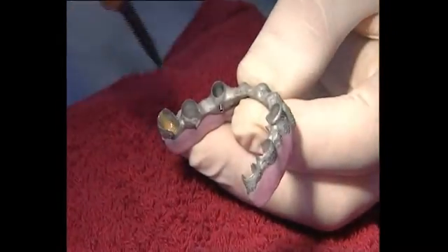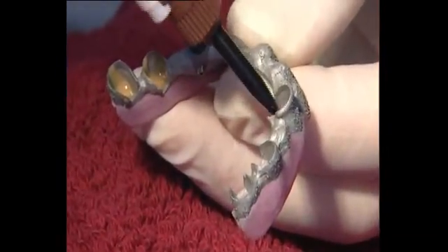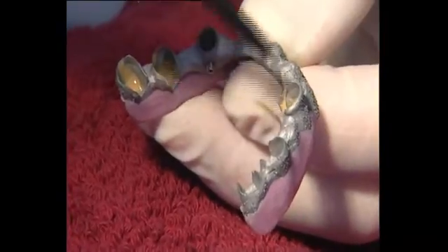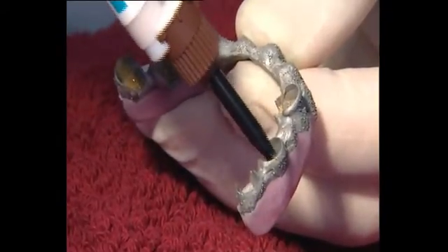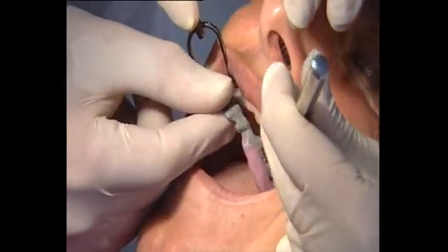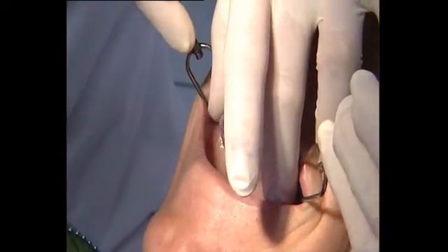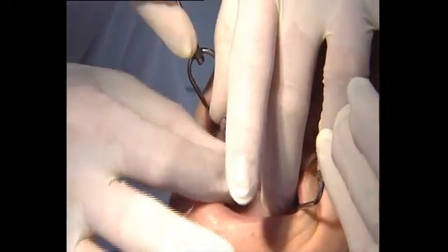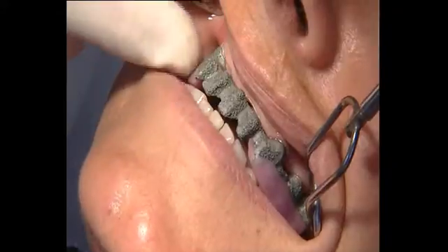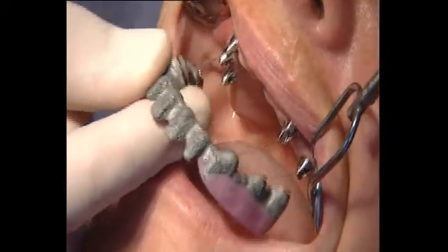The framework is removed. The titanium copings are placed in situ, conditioned with primer, and coated with chemically cured adhesive. The titanium copings ensure that the framework is fitted in the optimal position without pressure. This guarantees a completely passive fit of the framework structure on the implant.